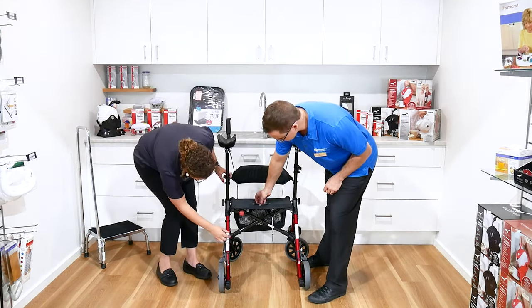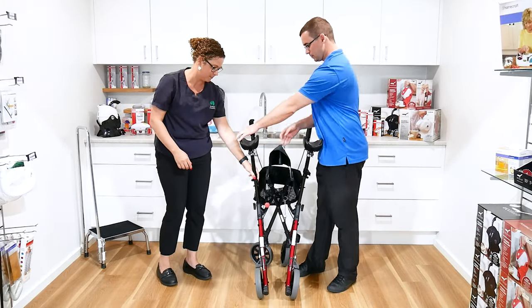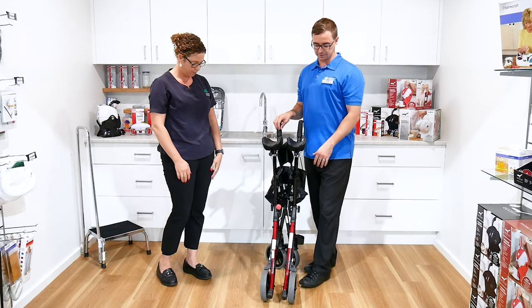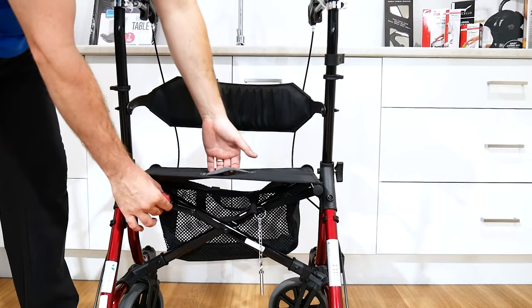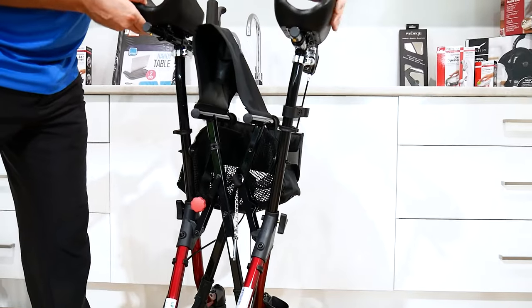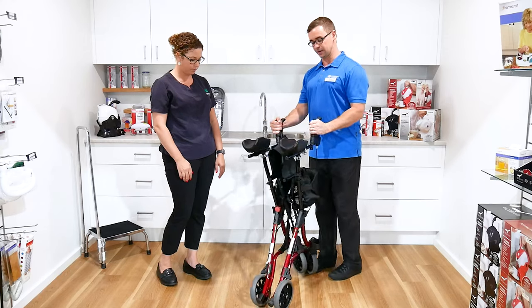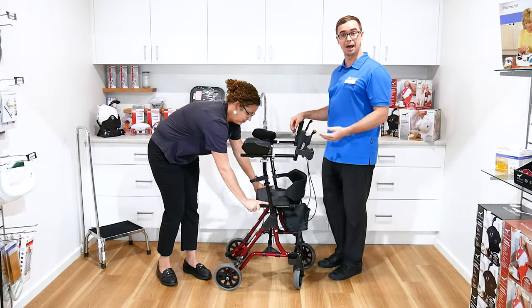So with the folding function — if you pull the little button there — it's easy to fold this up and then appropriately place it in a vehicle, whether that's a loved one, a formal carer, or support worker, placing it in the back seat or in the boot and then going out into the community. A really innovative solution that simply years ago was not in the market.